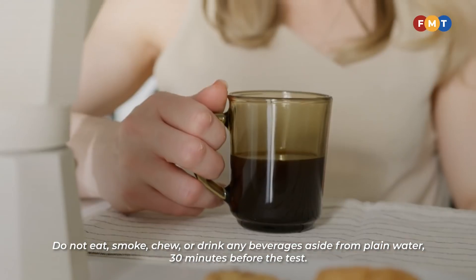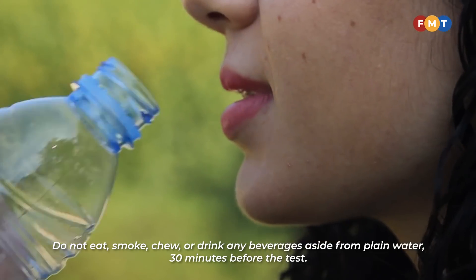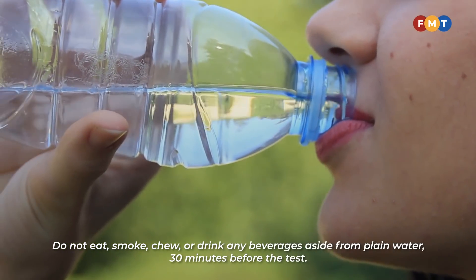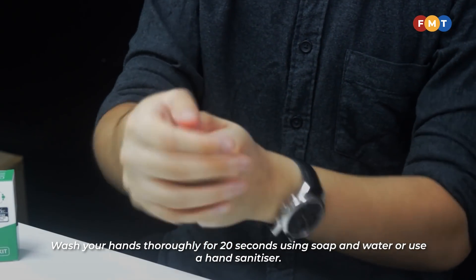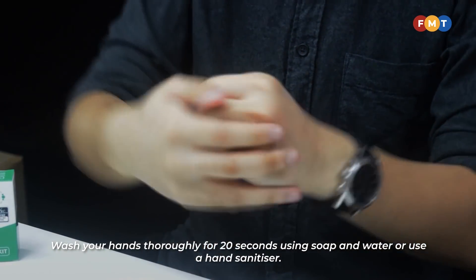Do not eat, smoke, chew, or drink any beverages aside from plain water 30 minutes before the test. Wash your hands thoroughly for 20 seconds using soap and water, or use a hand sanitizer.